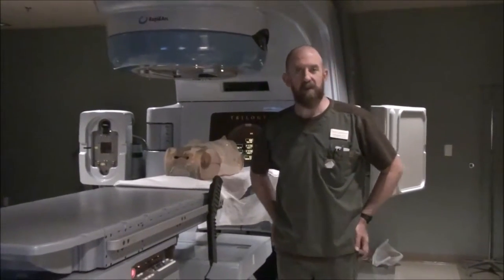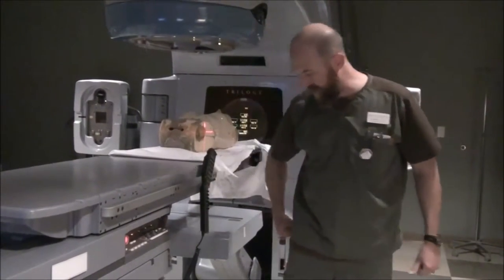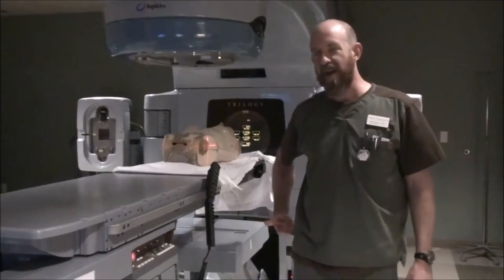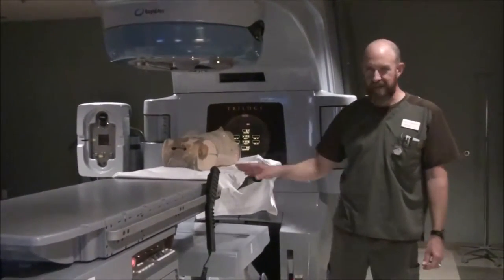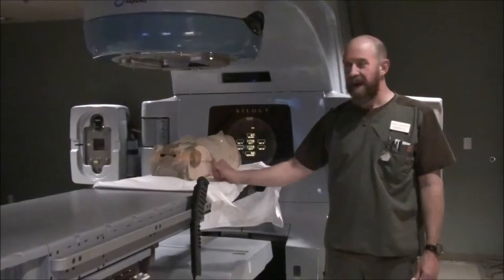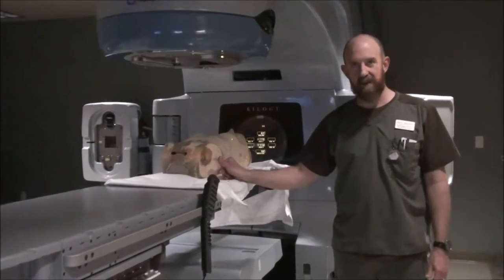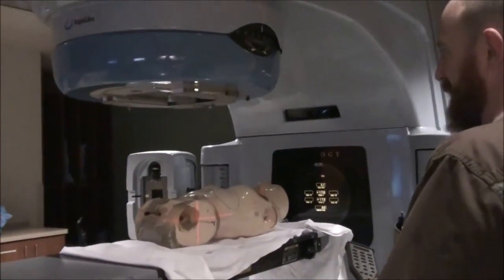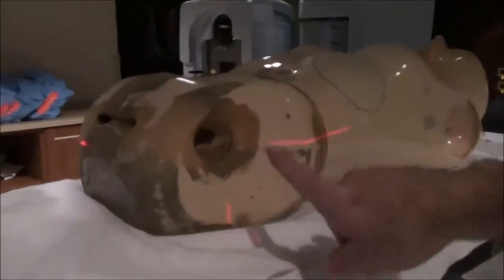For a prostate, you can palpate the greater trochanter — basically where your hip bone comes out. If you poke around and find where your hip bone sticks out, that's the end of your greater trochanter. Nine times out of ten, that prostate is right in line with that. That is the easiest palpation to do because it's not uncomfortable, you don't have to feel around anywhere else, and it works 99% of the time. So if you palpate that greater trochanter, just put your laser dead on that.